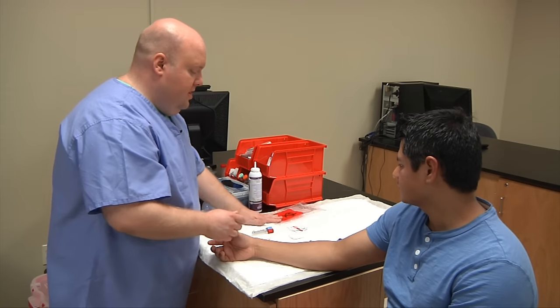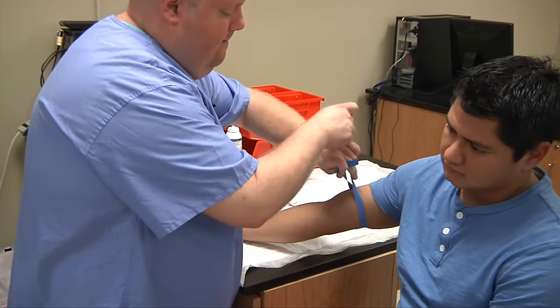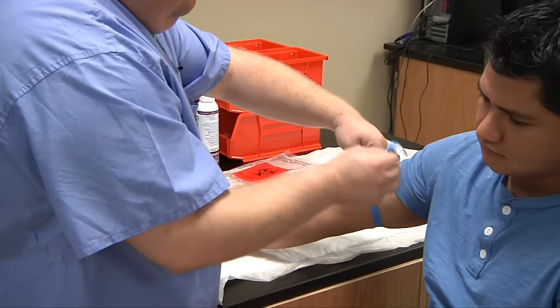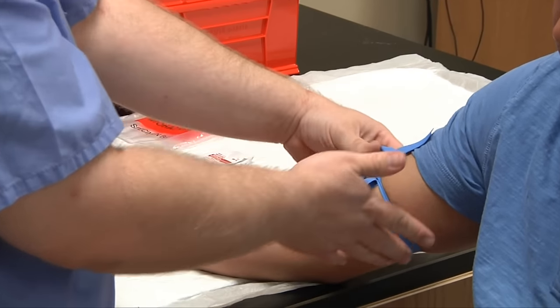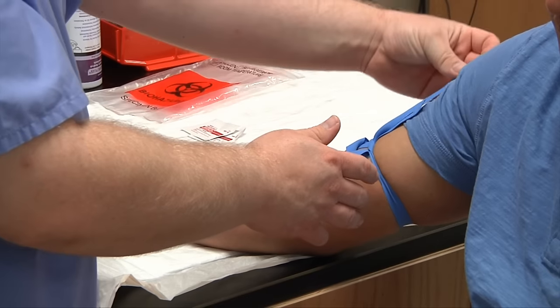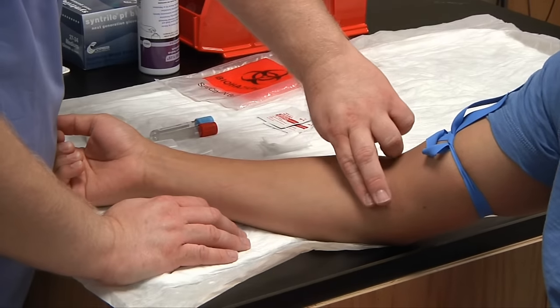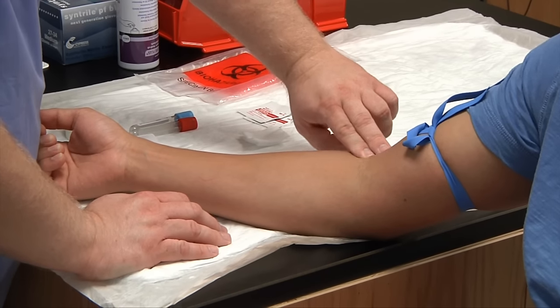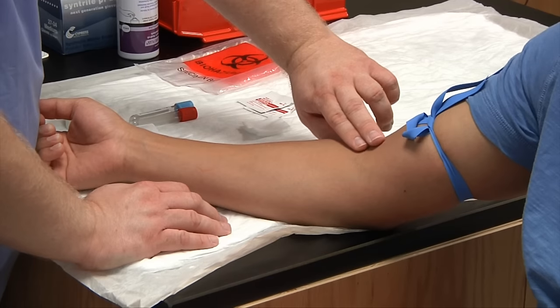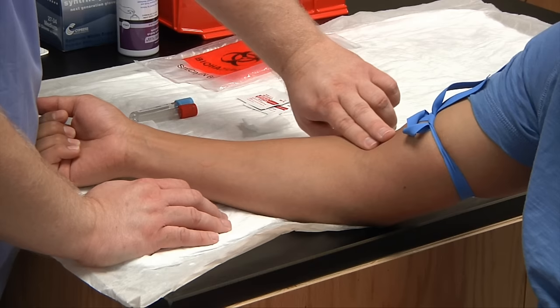So I have all my equipment gathered. Let's go ahead and begin. Apply the tourniquet, making sure it's flush in the back — try not to let it roll. You want bunny ears up, not frog legs down. Now you're going to palpate, going across and then coming back. With this patient I'm going to choose this vein here to do phlebotomy.